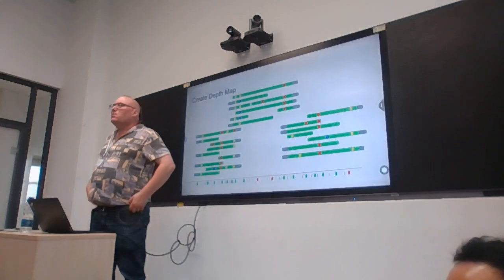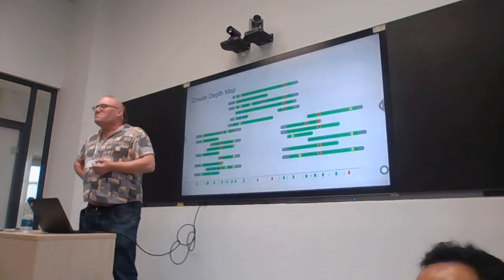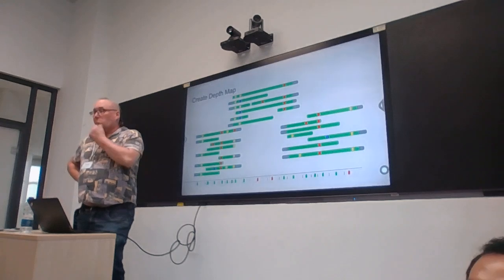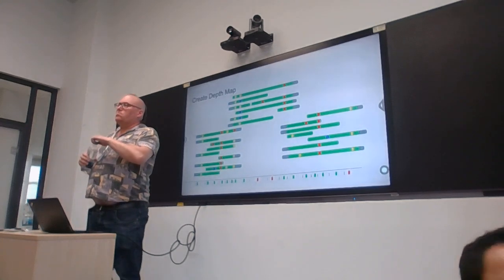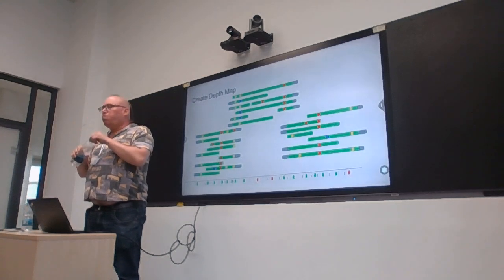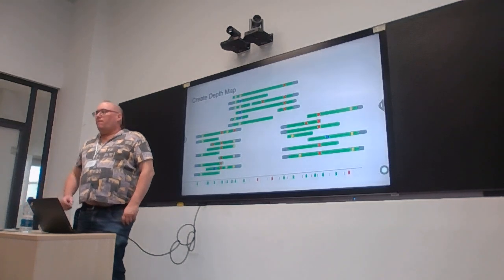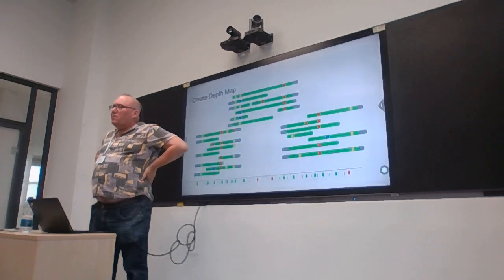On that part of the CT values, I think from our lab we have got an experience. Because at one point we wanted to give a cut-off, but you find that there are some samples that had higher CT values than other samples, and yet you recover something from the one that had a higher CT value and less from one that had a lower CT value.